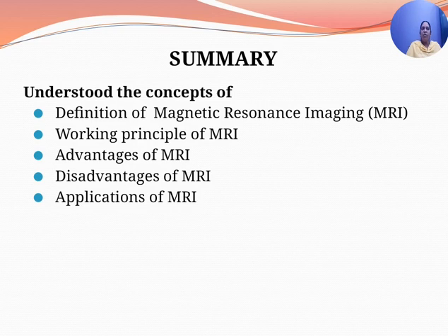Who can use these MRI scans? MRI scanning can be used for ailments of the brain, including tumors, sport injuries, musculoskeletal problems, most spinal conditions, vascular abnormalities, female pelvic problems, prostate problems, gastrointestinal tract conditions, ENT conditions, and soft tissue and bone pathological conditions.